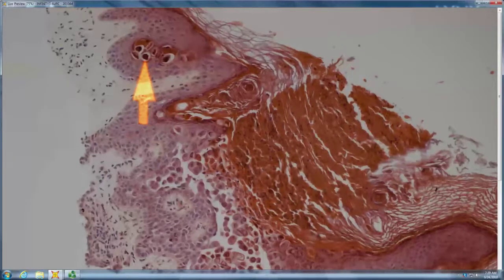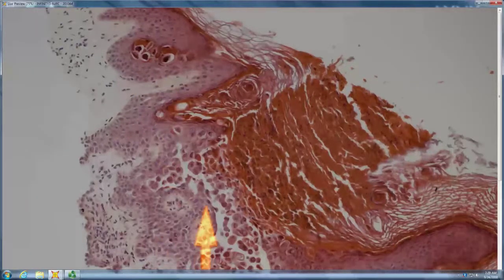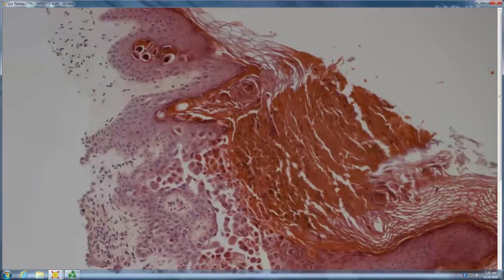Many of the circles around the nuclei are blue, whereas Hailey only does red. You have clear halos as well. So again, that's more Grover's, Darier's, vulvocrural dyskeratosis looks similar, whereas Hailey would be dilapidated brick wall and only ever red rings.